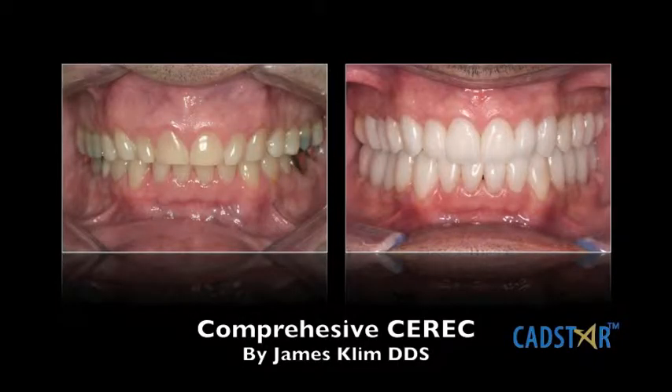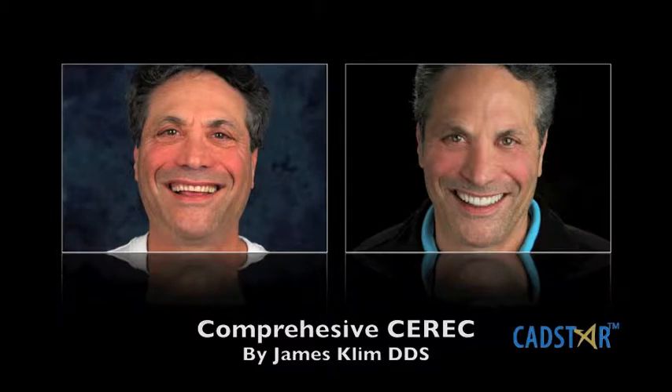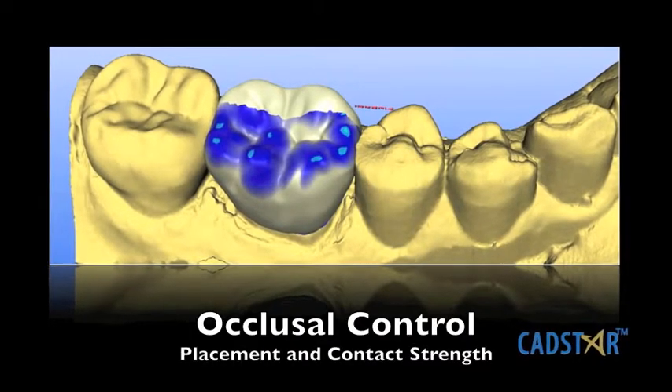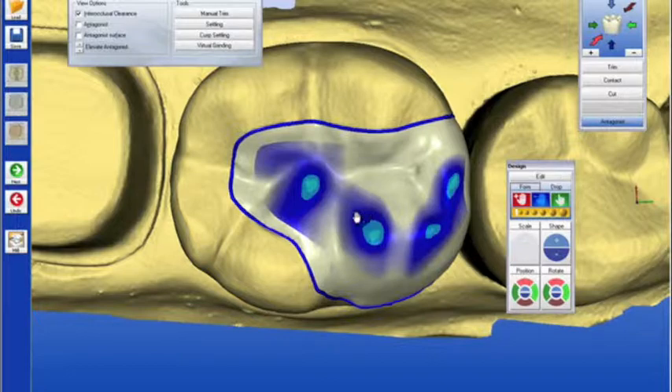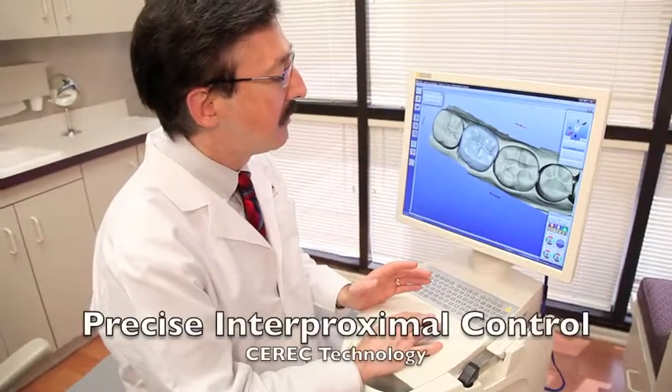I use it for comprehensive care as well. I was doing comprehensive care for years before the CEREC, so I took that background and systematically applied it to my CAD-CAM unit. It's made the control of occlusion remarkable. With my CEREC and a good accurate bite registration, I can control where I place my occlusal contacts and the firmness of those contacts. When it comes out of the milling unit, I have my system down to 20 microns of precision — and my hair here is over 100 microns. That ability to control occlusion is a huge factor in my comprehensive care.